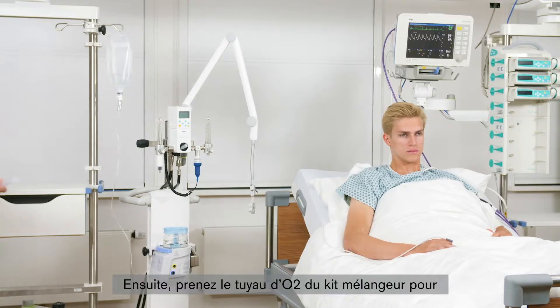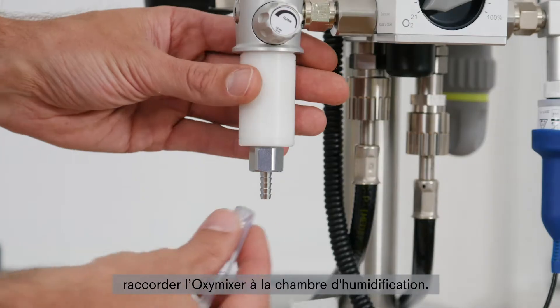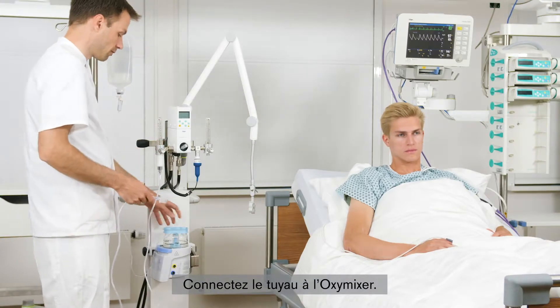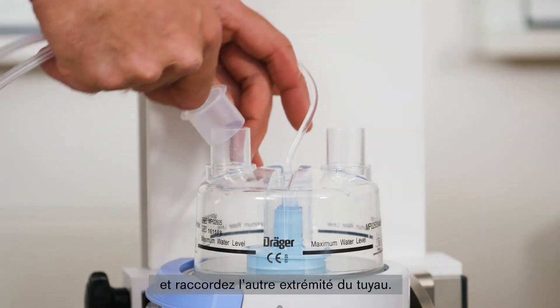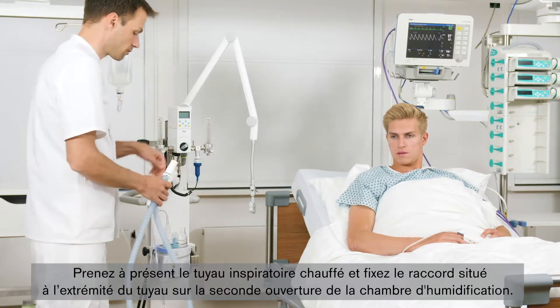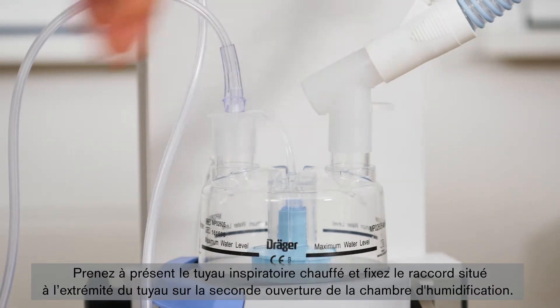Next, take the O2 hose from the blender kit, which is used to connect the OxyMixer to the water chamber. Connect the hose to the OxyMixer. Remove the sealing cap of the humidifier chamber and connect the other end of the hose. Now take the heated inspiratory hose and connect the connector at the end of the hose to the second opening on the humidifier chamber.